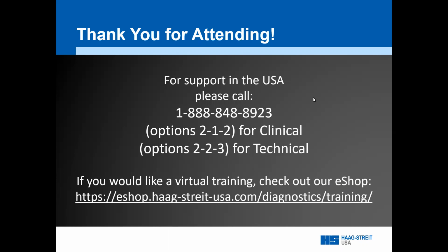I recommend being on our iSuite version i9 6.3. I find that's like the best release that we've come out with. And it does require a Windows 10 PC with certain specifications, so plenty of memory. You want to check with our technical support team to make sure that your computer is meeting the specifications for that version of software. And that's the option 2, 2, and 3. They'll be happy to help you. And if you need to upgrade your computer, we could also provide you with a computer with the software already loaded.